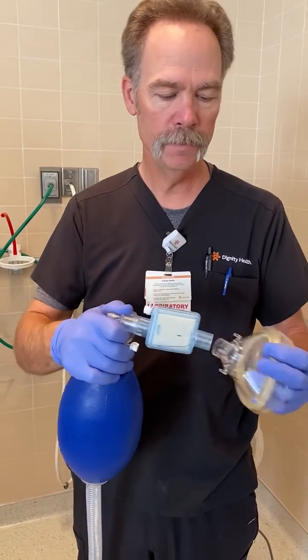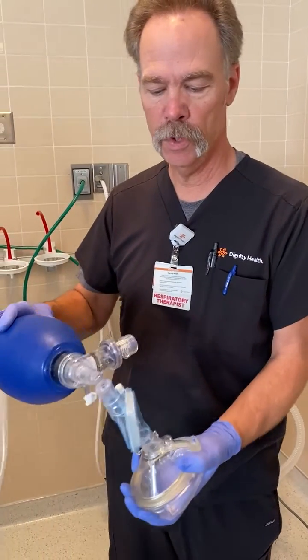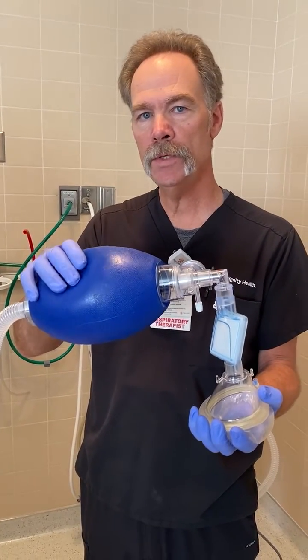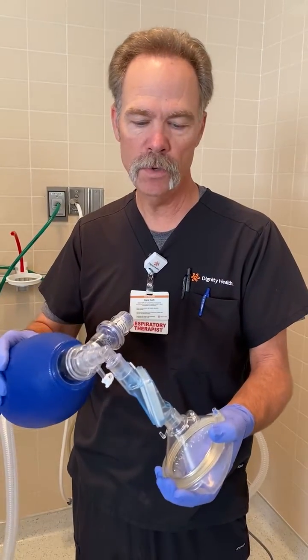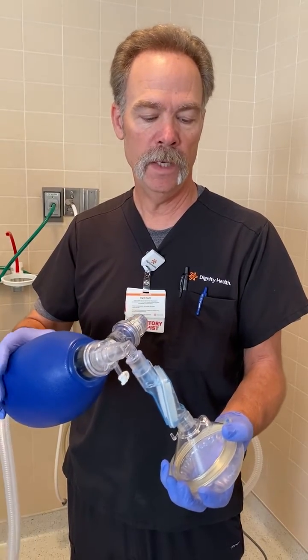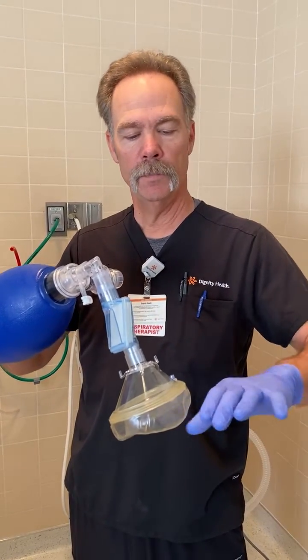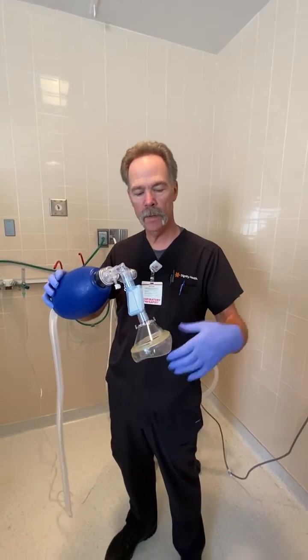You'll put your mask on, and then you can support your patient and bag them. Nice and easy. This is a thousand cc's, but we only want to give them about 300 cc's when we bag. See the chest rise. You can put this on and support them also — the PEEP will really help them. And if they need to be ventilated, you can do this. You don't want to over-ventilate them and cause high pressures where you're going to have particulates come out here — fomites.